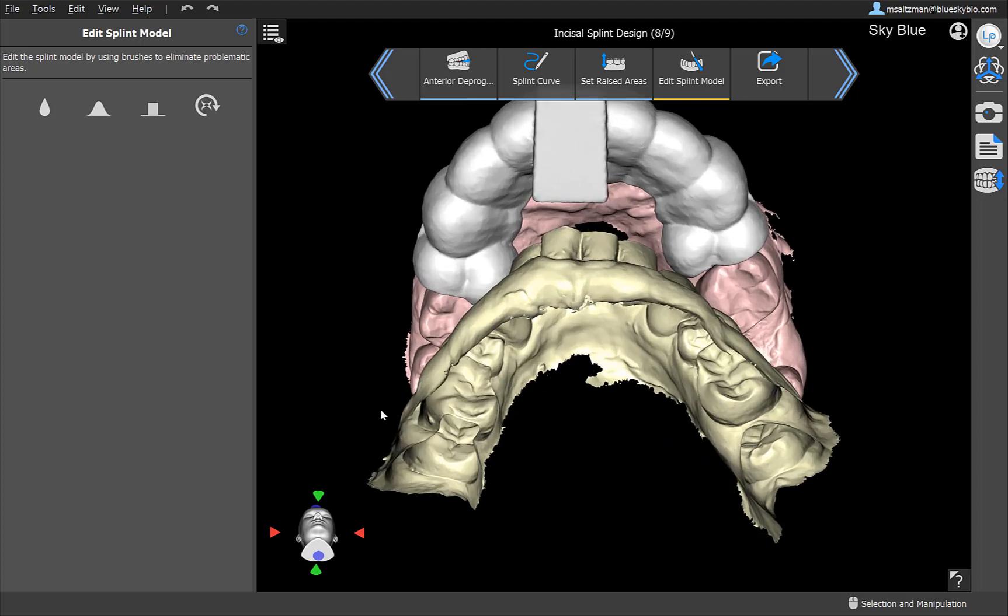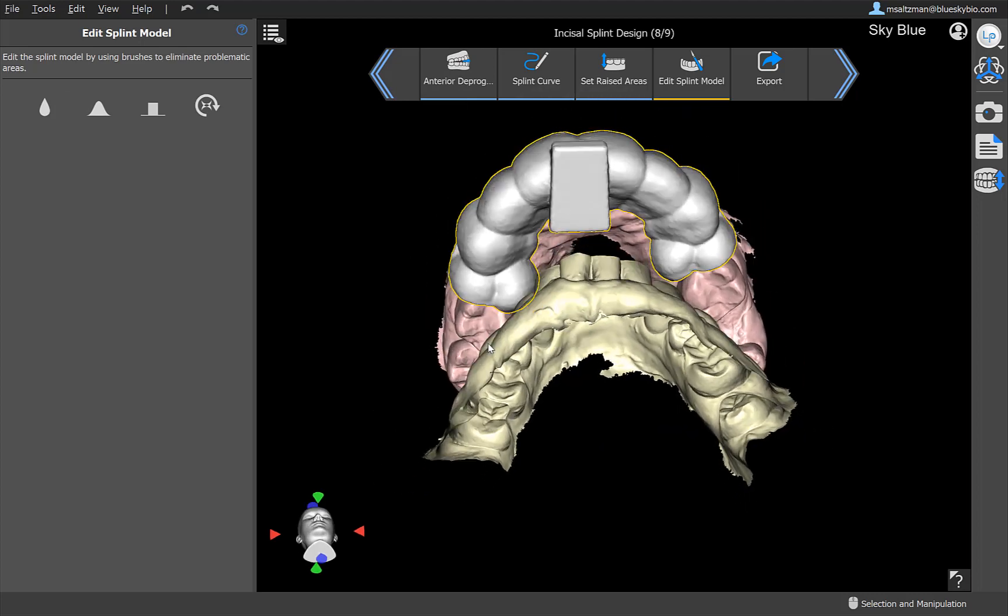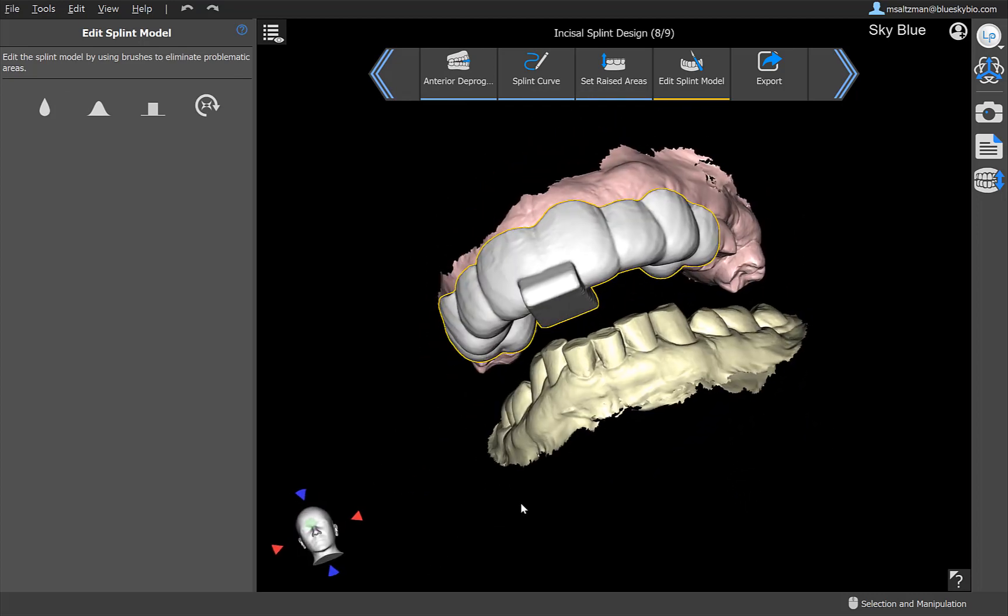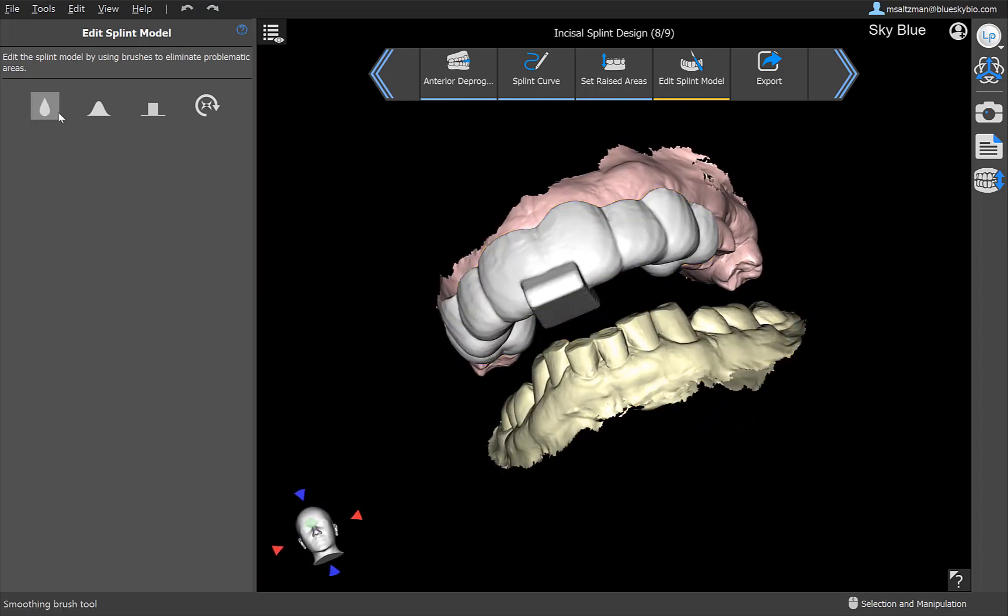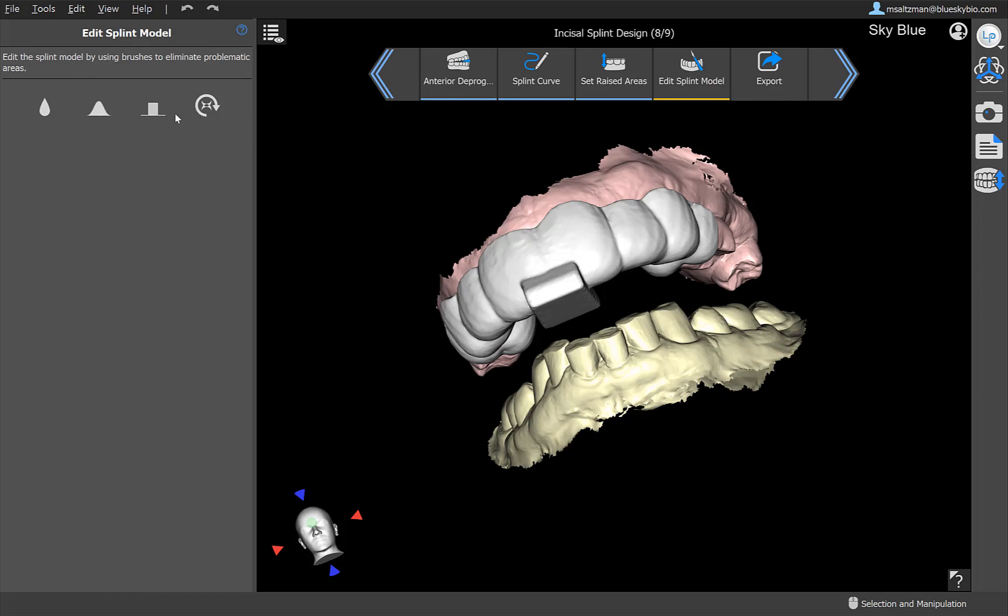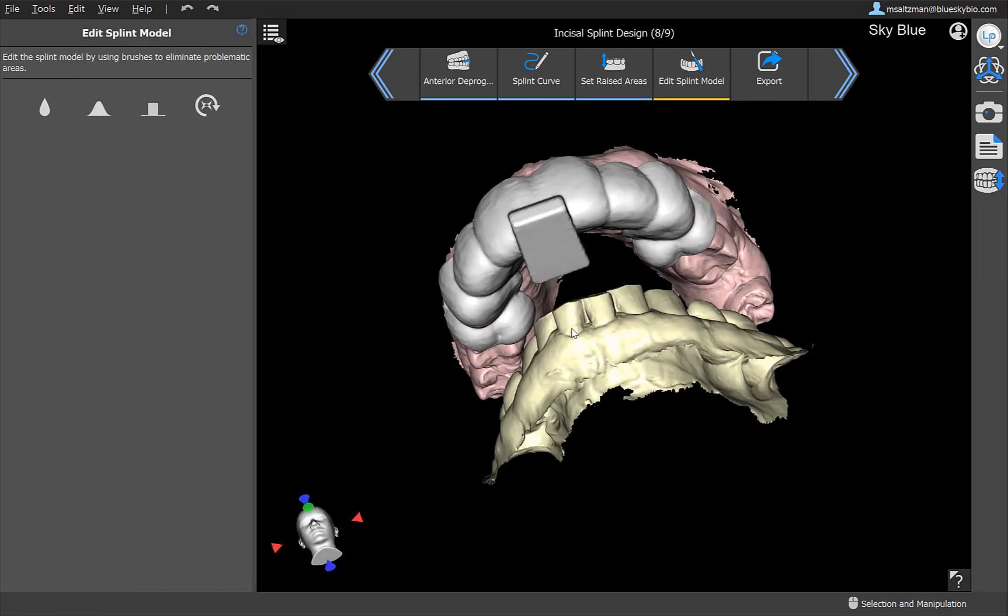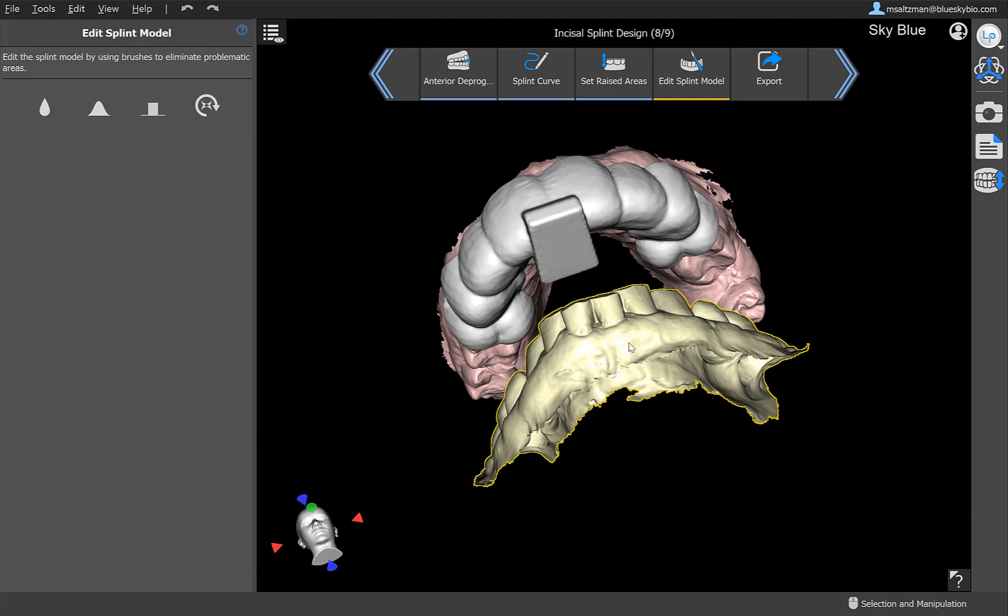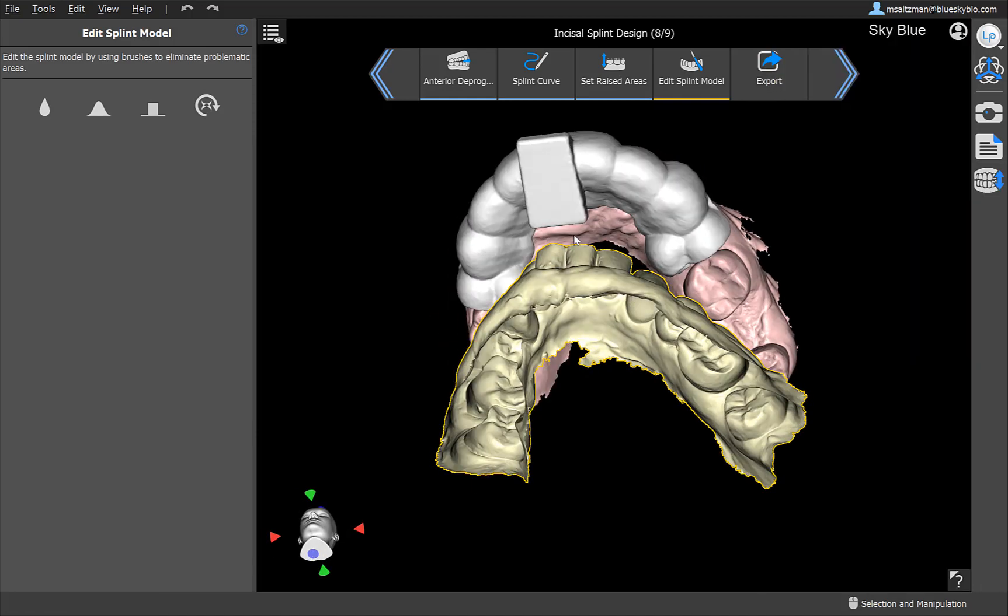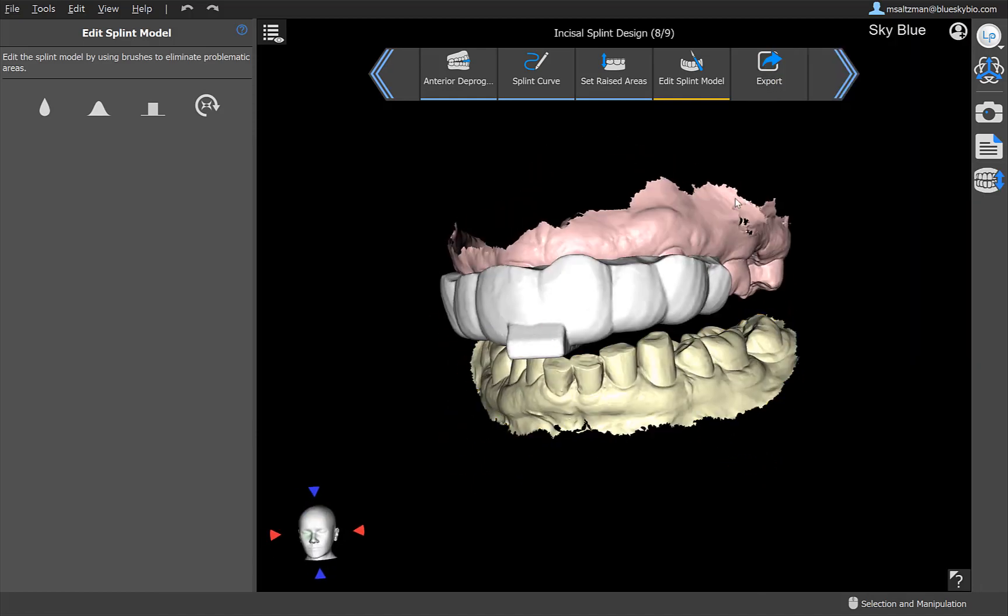And before going to export, we have the editing tools available once again as a step in the process flow. You could smooth, add and remove materials, local deform, or resolve collisions. Again, you could open and close the bite. And once the splint is ready for export, go ahead and click on next.